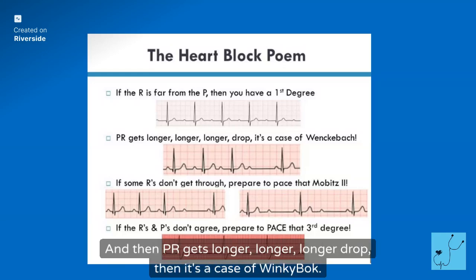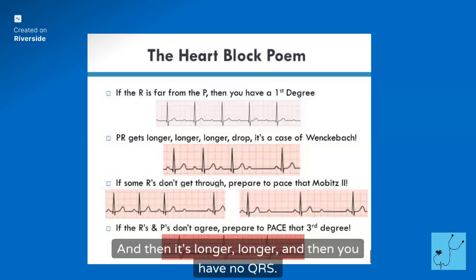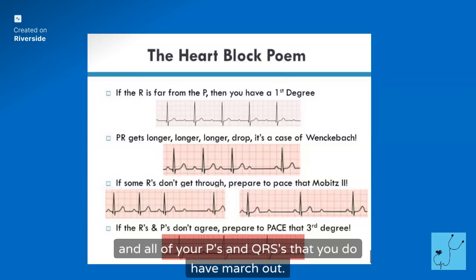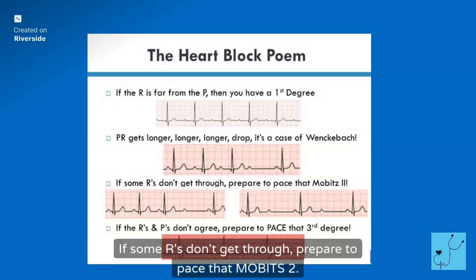And then PR gets longer, longer, longer, drop, then it's a case of Wenckebach. The PR here is one measurement. It actually looks pretty normal here. And then it's longer, longer, and then you have no QRS. And all of your Ps and QRSs that you do have march out, okay? If some Rs don't get through, prepare to pace that Mobitz 2.